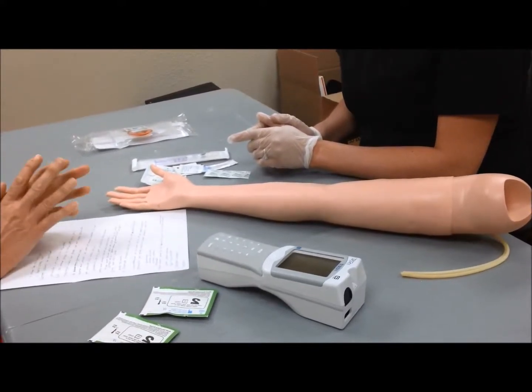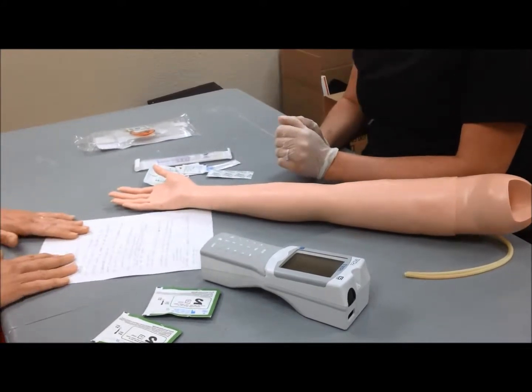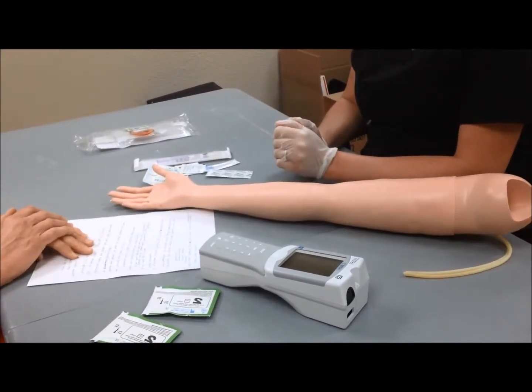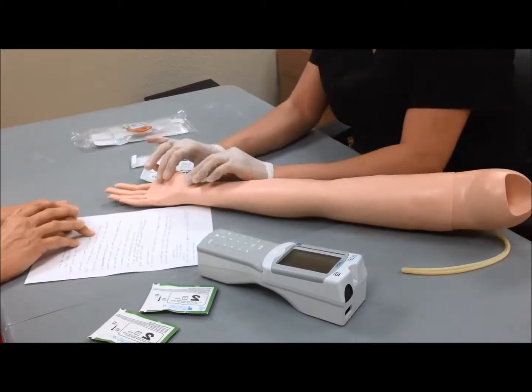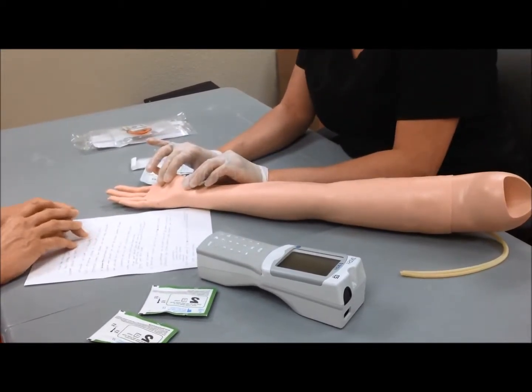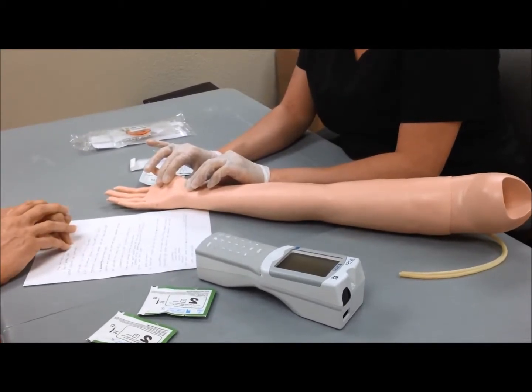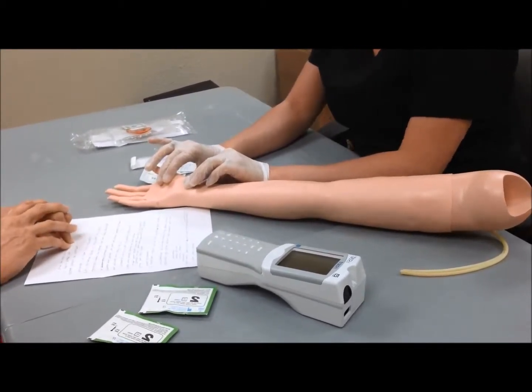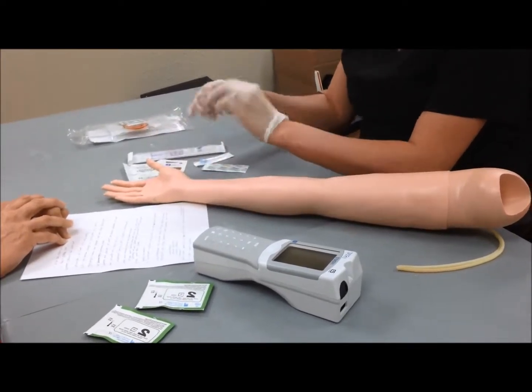If possible, if you have a talking patient, inform them that you will be doing a blood gas on them. Enter the patient's room. Find the best area on the patient's arm where the pulse is the strongest. This may take a few minutes. Once you have found the best pulse, you need to swab that area with an alcohol pad.